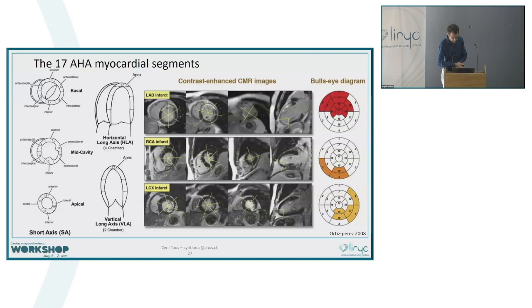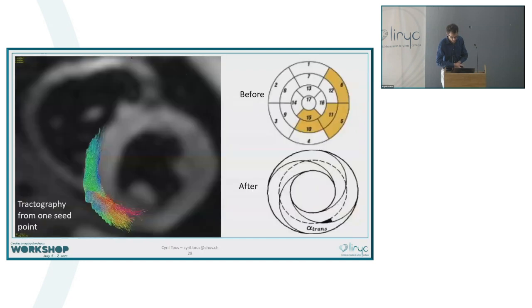You often see these graphs, the way we segment the heart is very Cartesian. We can see that some of the segments are affected and some not. I think we need to rethink how we segment the heart, because most likely it's because of the way the fibers are affected, and so all the signals might actually be linked because of the fiber configurations.